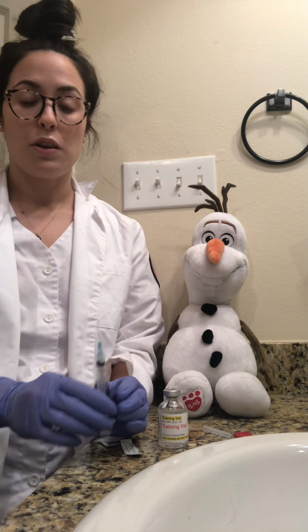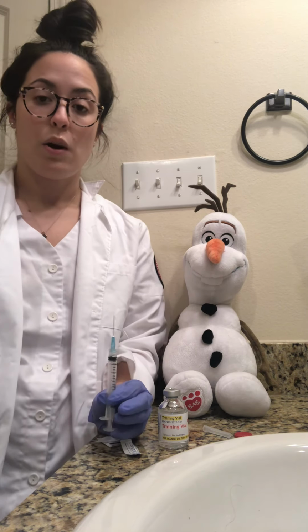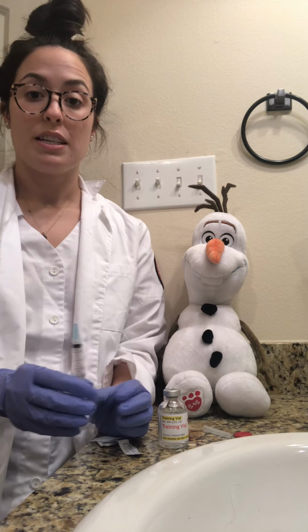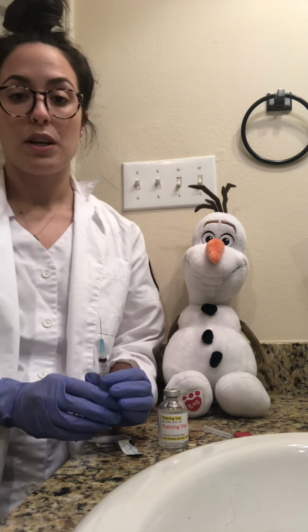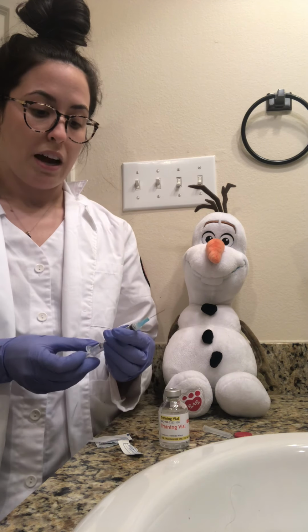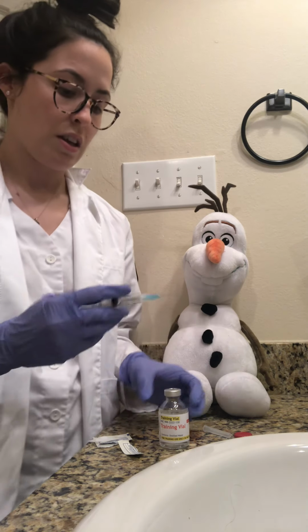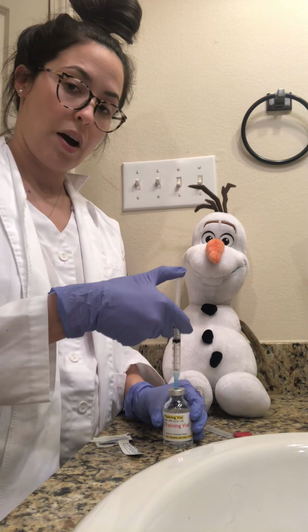Besides those 4, you also want to make sure you administer at the right time, which you would check on your MAR, and this is the right time for this medication to be administered. And you want to also have the right indication of the medicine, so this patient is being given it for the right reasons. Alright, and so next thing we're going to do is draw up the medicine from the vial, and by doing that we're going to pull back 2 milliliters in the syringe and inject it into the vial.